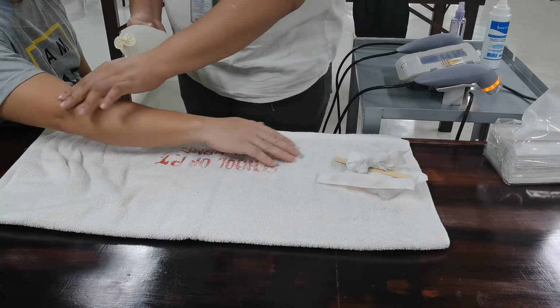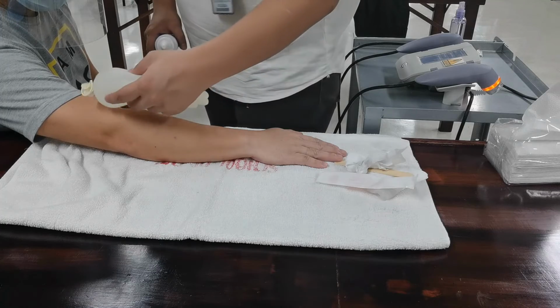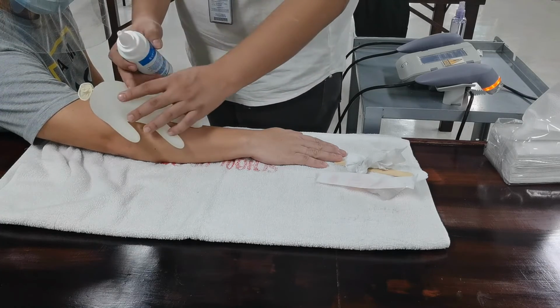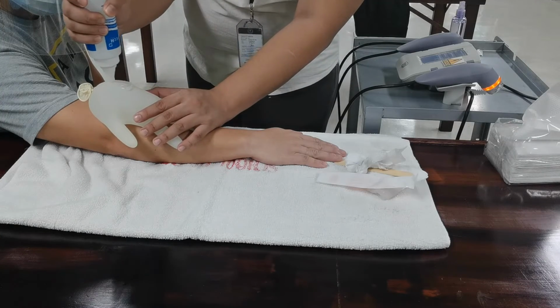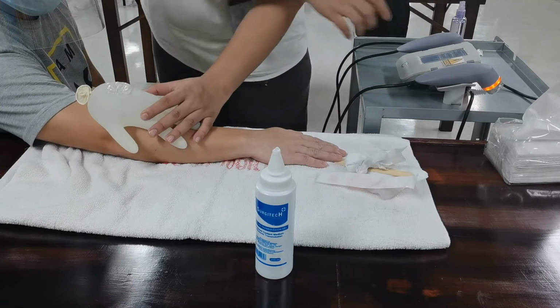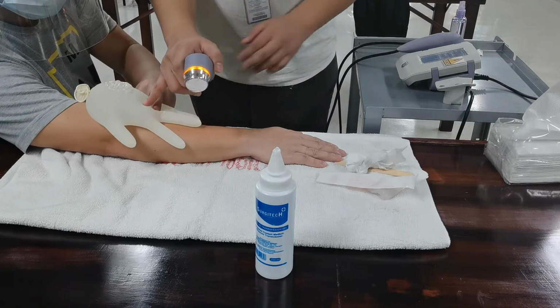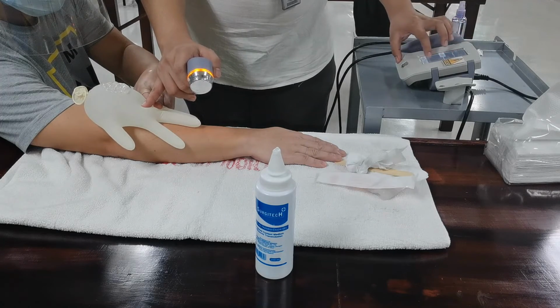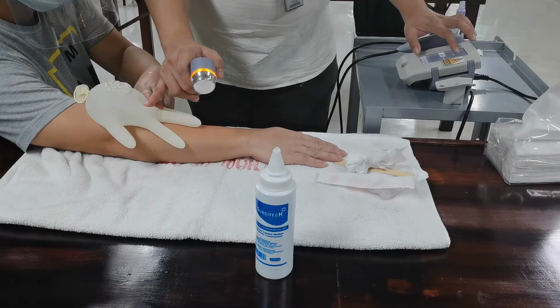So next would be the glove technique. The glove technique is usually used for areas that have bony prominences. So in this example, we are trying to treat the lateral epicondyle. You fill a glove with water, and the same as before, when you're about to perform the treatment, apply ultrasound gel to the ultrasound head for lubrication. And again, it should be in constant contact with the glove. So again, this is called your glove technique.